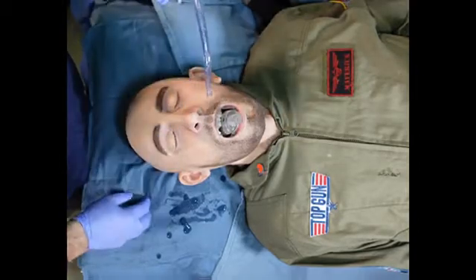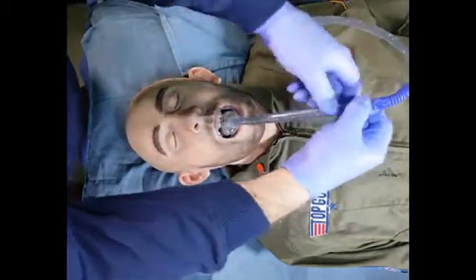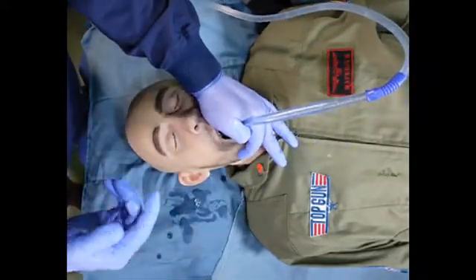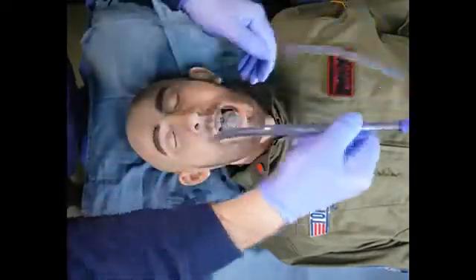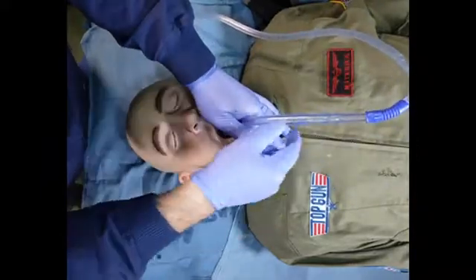Second way is the rapid airway decontamination maneuver, or RAD, where I place the rigid suction catheter into the 15mm connector, make a seal with my hand, and I literally use the supraglottic as a suction catheter itself. I also call this the cornholio maneuver because we are making a little artificial sphincter.